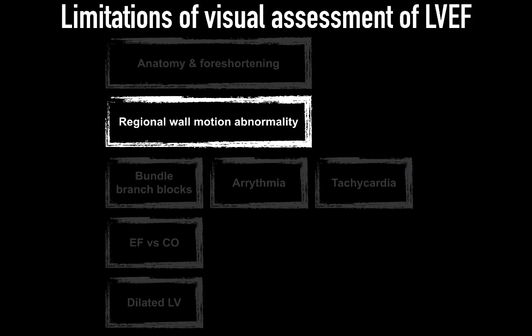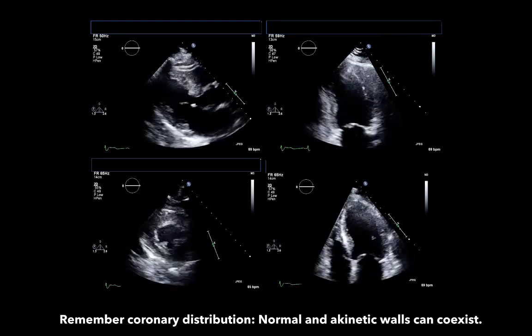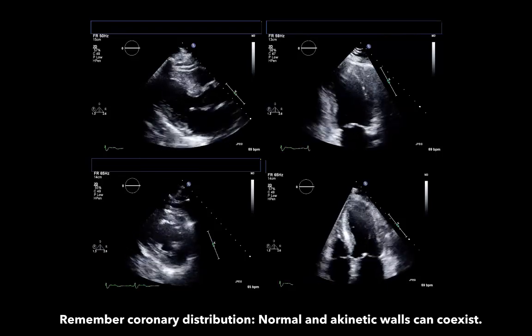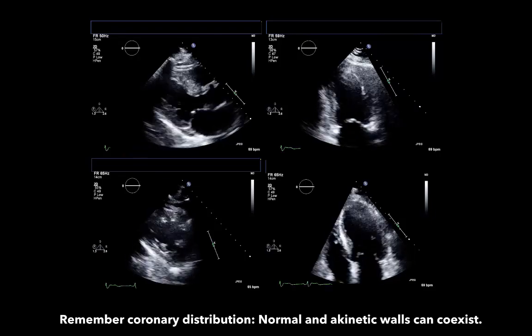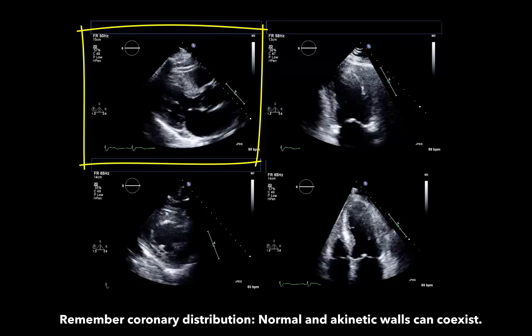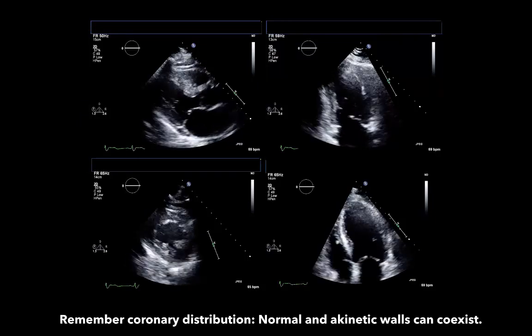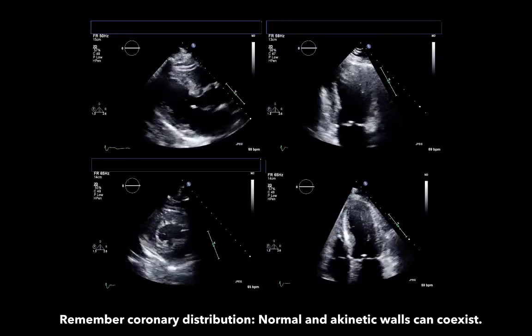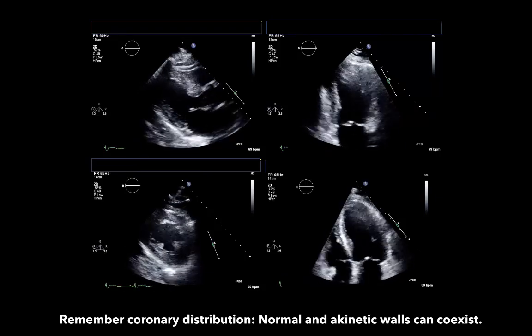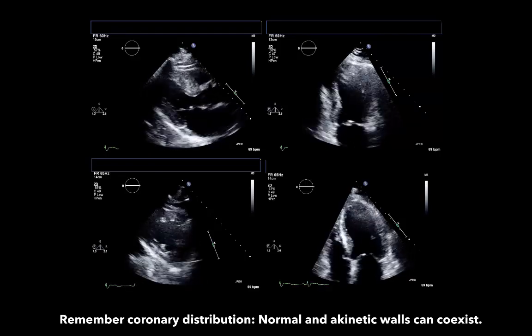Let's explore regional motion abnormalities. In the following set of clips, all from the same echo, there is significant hypokinesis in the anterolateral and infralateral/septal walls. Comparing the views, you'll see they appear to have different LV ejection fractions. The parasternal long-axis view on the top left has a markedly lower LVEF compared to the rest. Because of coronary distribution, normal and akinetic walls can coexist, causing apparent variations in ejection fraction. This illustrates that we're using 2D planes to evaluate a 3D structure, so a single view gives gestalt but may not represent the full picture.